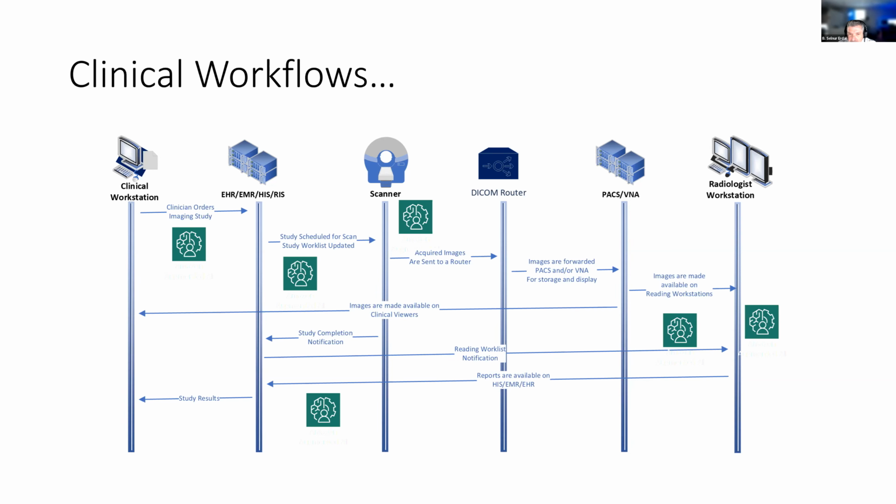And to tell the story, I'll start with describing a basic order-based radiology. When I say order-based, I mean an exam is ordered by a clinician, and radiology imaging is going to be performed. Then results are going to be returned for that exam, in the clinical setting.